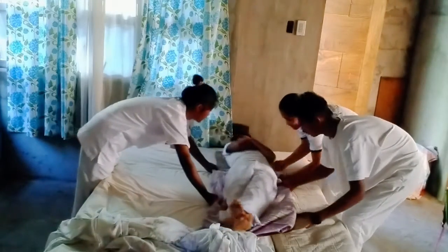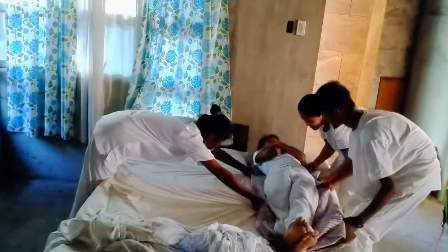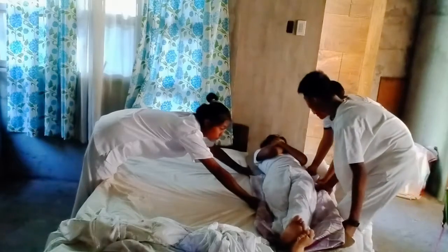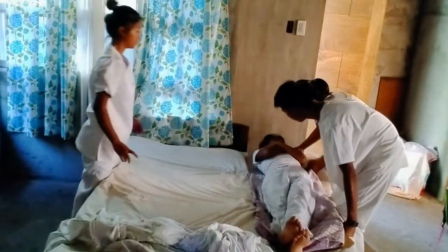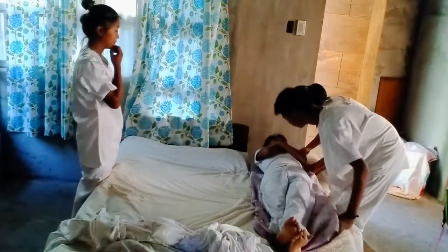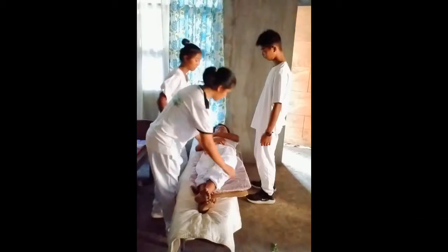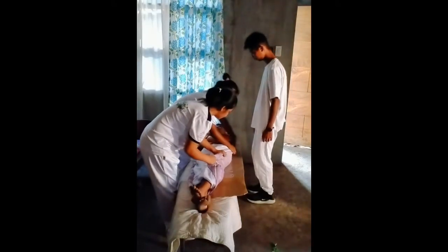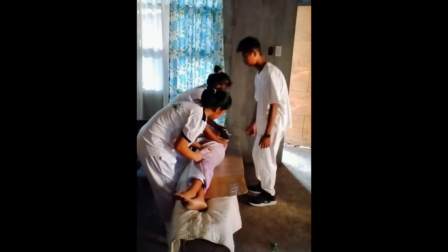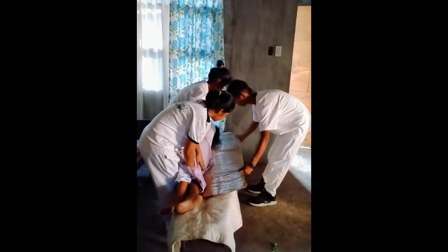On the count of three, slide the patient on the slide board over to the stretcher. Then position the patient in the center of the stretcher. On the count of three, remove the slide board from underneath the patient.